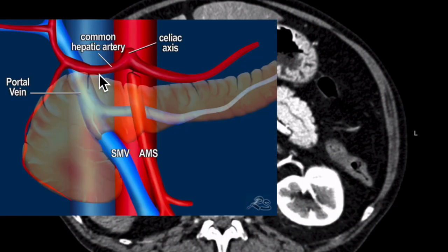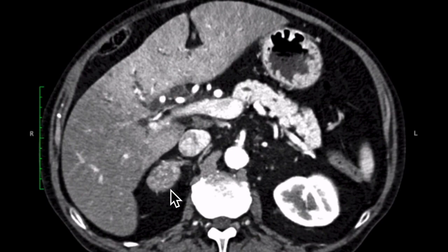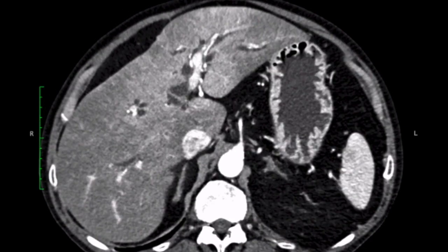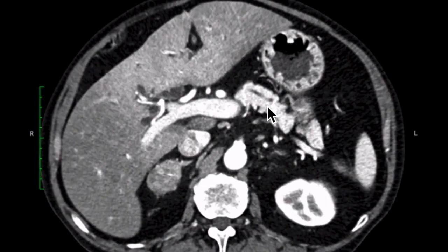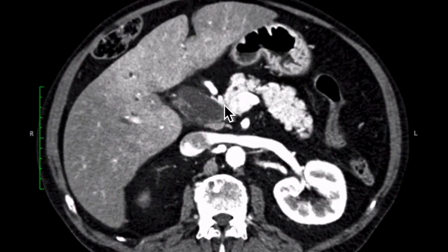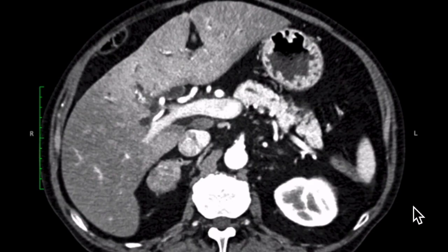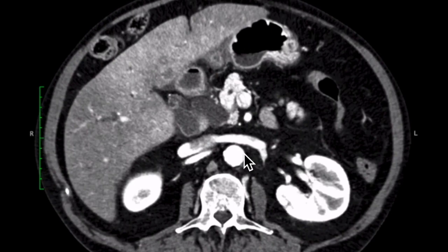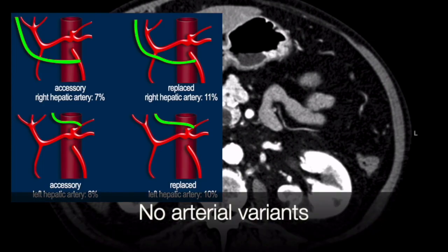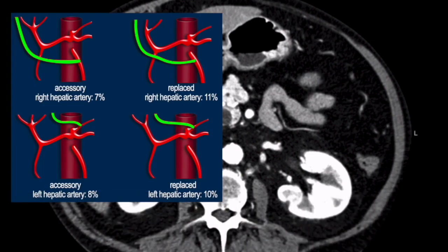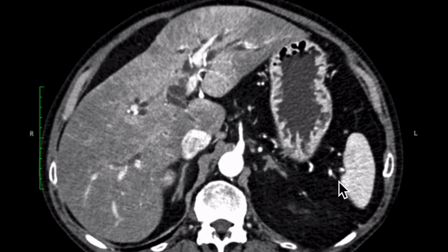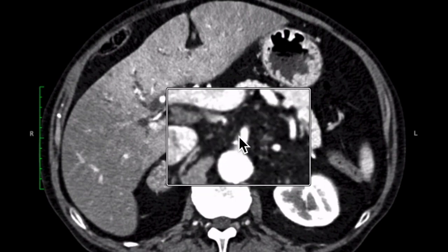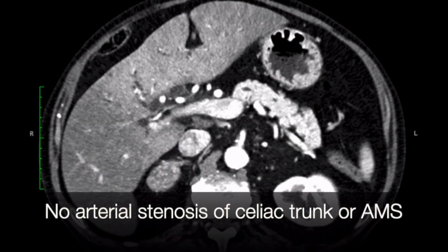The next step is assessing the arterial anatomy. The celiac trunk gives off the common hepatic artery, which gives off the gastroduodenal artery and becomes the proper hepatic artery. The superior mesenteric artery does not give off any additional branches. So in this case, there is normal arterial anatomy. We also assess for stenosis: no stenosis of the celiac trunk, and some mixed plaque at the origin of the superior mesenteric artery, but no significant stenosis.